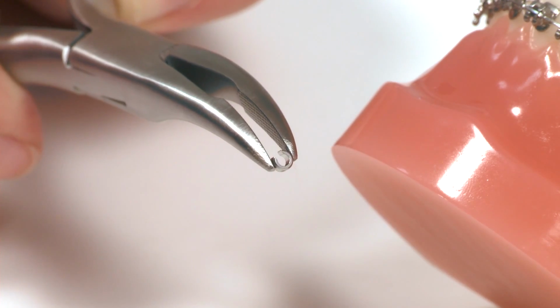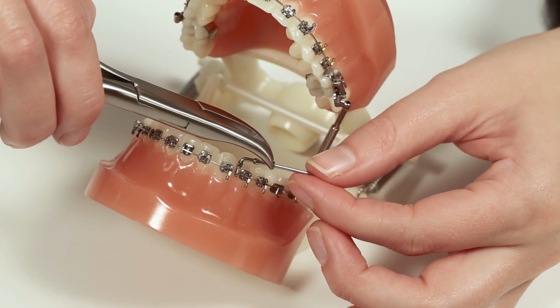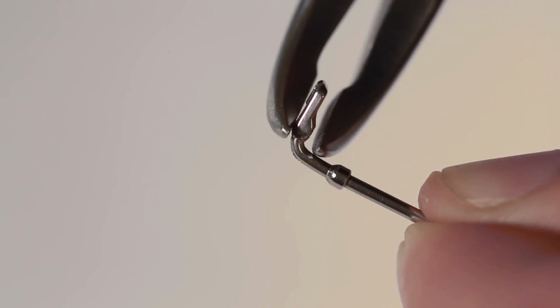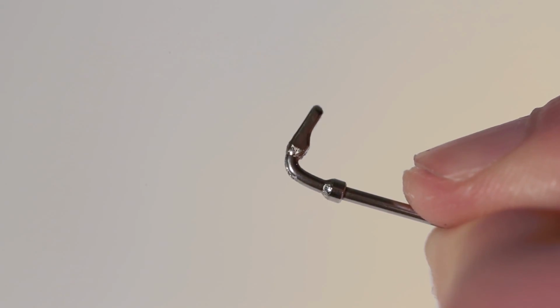To reactivate Esprit during treatment, add a 2 millimeter crimpable stop distal to the welded stop and crimp using a Weingart plier. You can also add bends to the pushrod to adjust freedom of movement, though this isn't usually necessary. When bending pushrod, always add the bend just below the mesial hook.